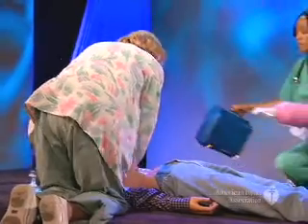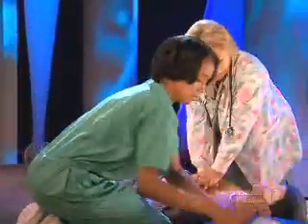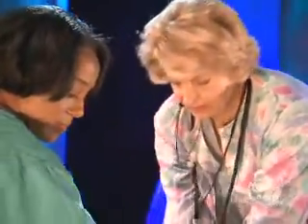When the AED arrives, put it near the rescuer who will be operating the AED and turn it on. Some AEDs turn on when you lift the cover. Others have a power button. Apply pads to patient's bare chest.